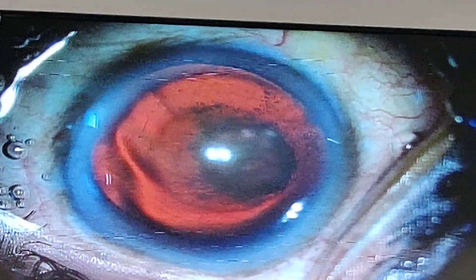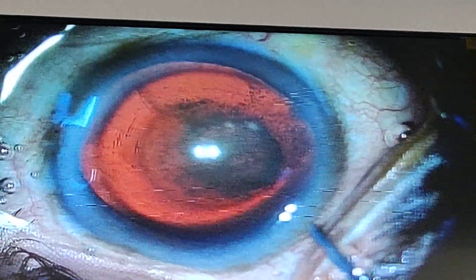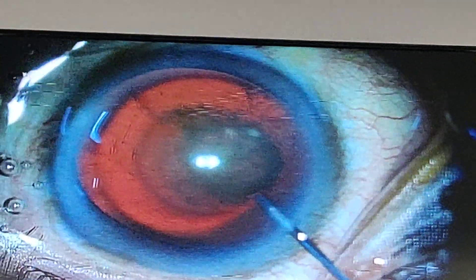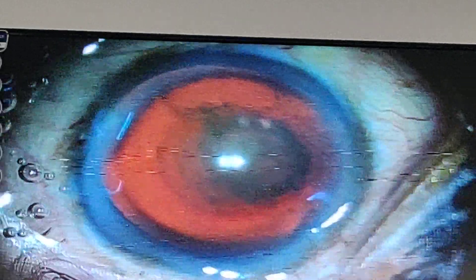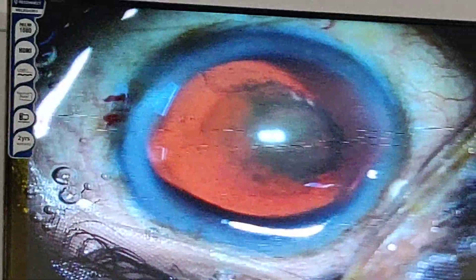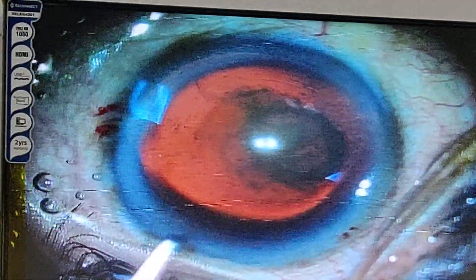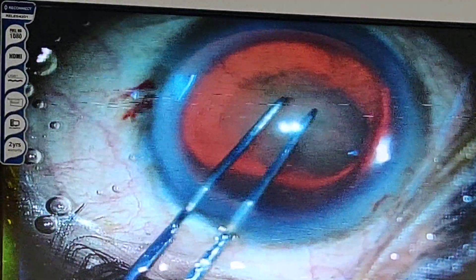This is my other side port incision, and I am going to inject a little more viscoelastic so that the chamber will become deep and I can work 180 degrees. This is my main incision and I am going to create a capsulorhexis of about 5mm in size.